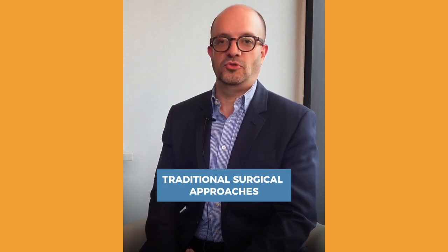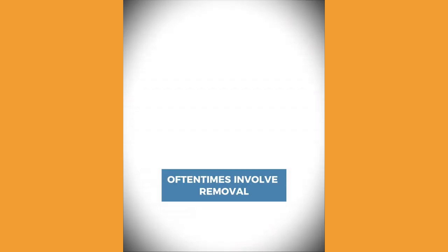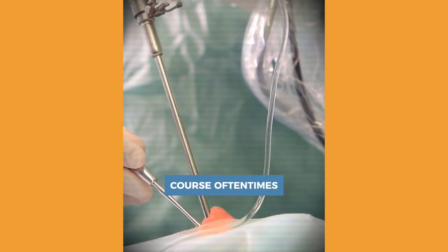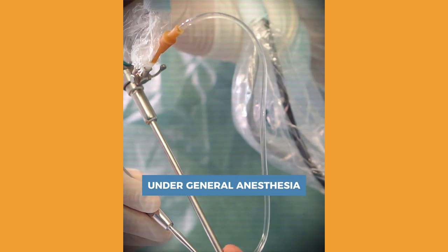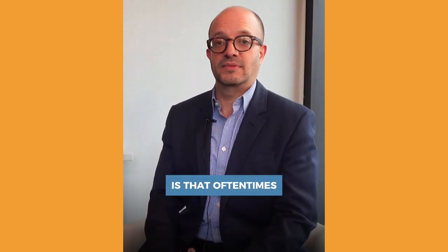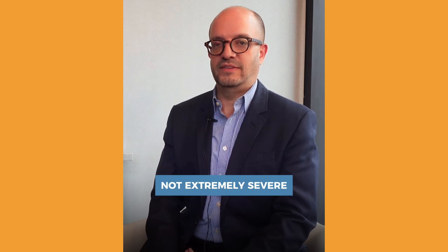The main difference, though, is that the traditional surgical approaches in functional endoscopic sinus surgery oftentimes involve removal of tissue, more aggressive techniques, and then, of course, oftentimes they need to be done in the operating room under general anesthesia. What we've learned over time when it comes to the sinuses is that oftentimes for disease that's not extremely severe or some other abnormal cases, less is more.